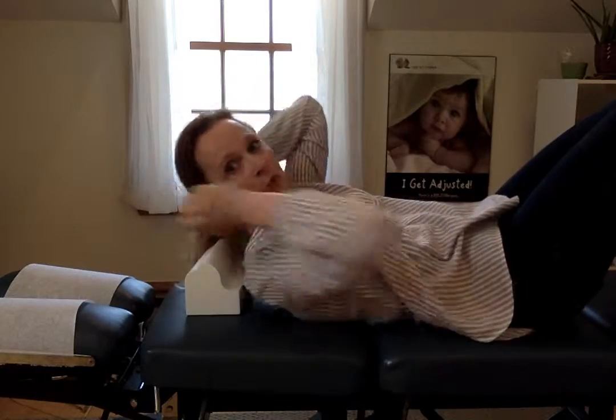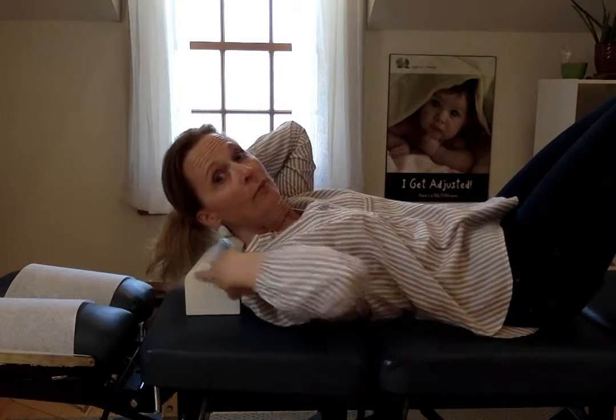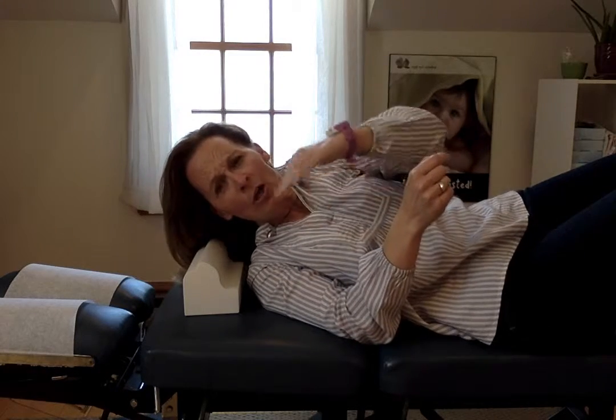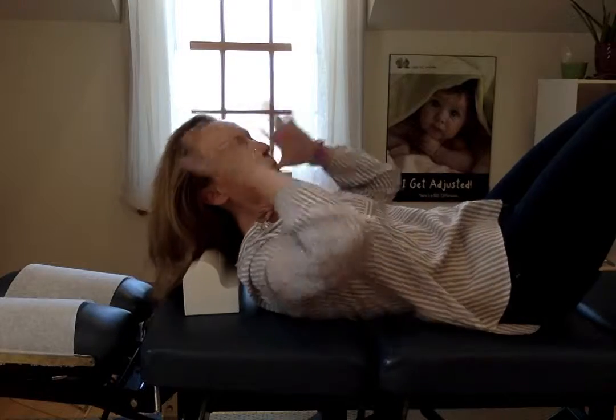So this is the easiest exercise you'll ever have to do. You just lie on it. I'll move my hair so you can see. You want to make sure that the curve, the very highest part of the foam, this part, is right against the part of your neck that I told you it needs to be against. Like I said, for most of you, it's going to be way down low, right near that big knob at the top of your back.